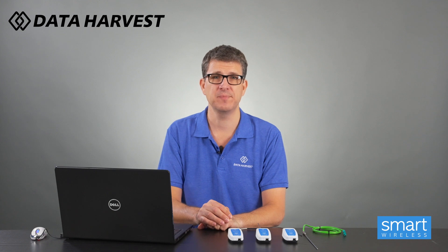Hello, I'm Lee from Data Harvest. Today I'm going to go through our three temperature sensors and explain which one is best for which experiment. It's one of the most common questions that we get. We have three temperature sensors that we sell, which are the wireless Bluetooth temperature sensors.